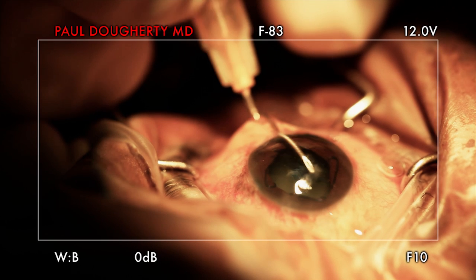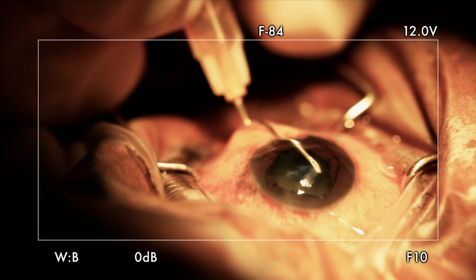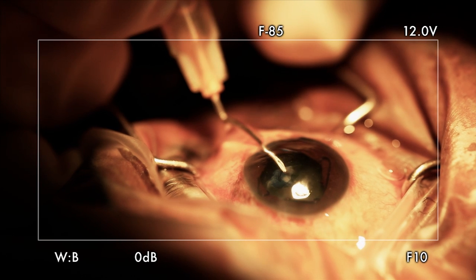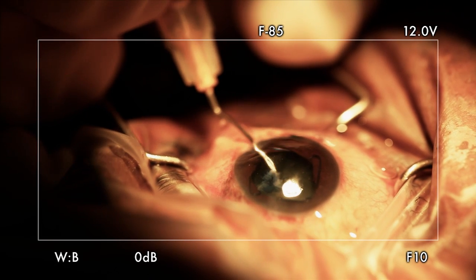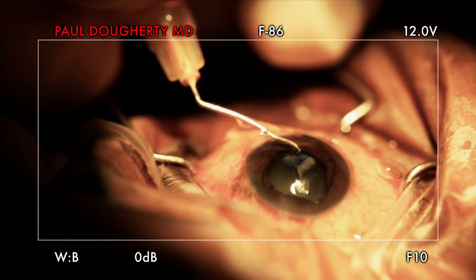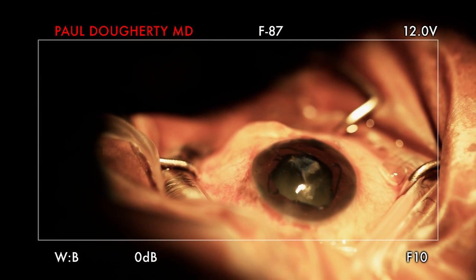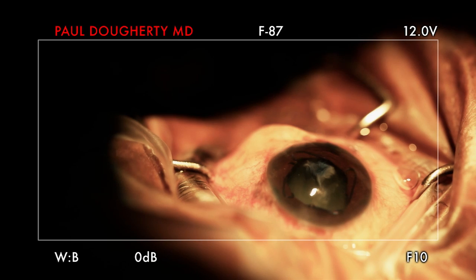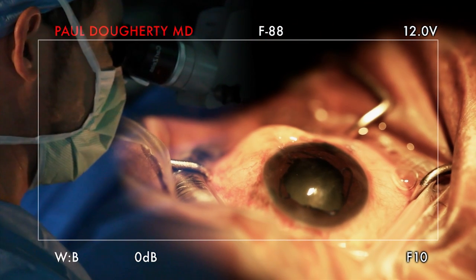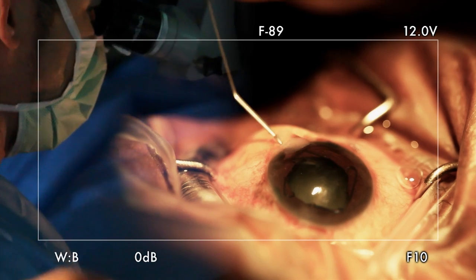One more — what are they doing next? It's a pediatric case. It's a little thing. Perfect. That was thick. Can I have a forcep? Some kind — like a tiny forcep. I just want to get the capsule out of there. Next I need to hydro-dissect. There's the capsule. And this, of course, is a dense cataract.